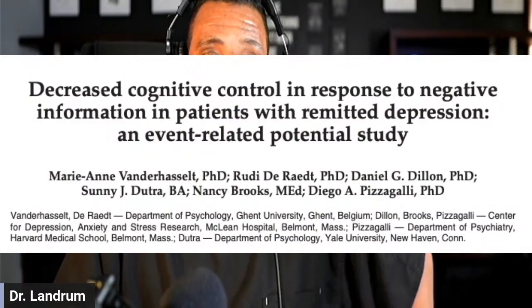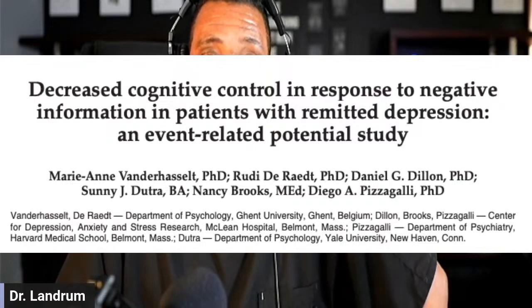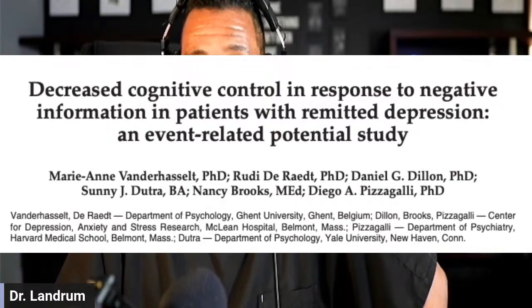So if we know all of this, why use the other fancier thing that's called an ERP? So again, that ERP, as represented in this paper, stands for event-related potential. The reason why is because when we use this in combination with these other studies, we can see improved accuracy. So as opposed to us just guessing, why would we not want to know this in more detail? So an ERP is different.